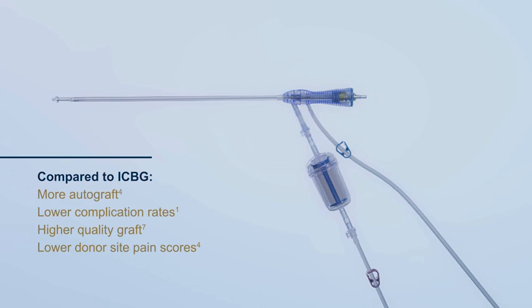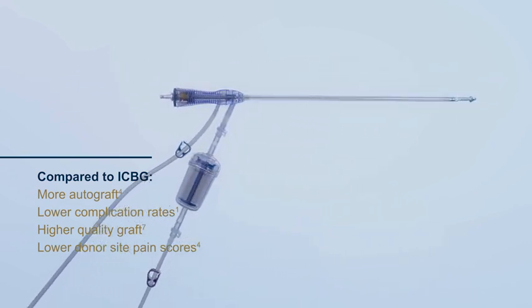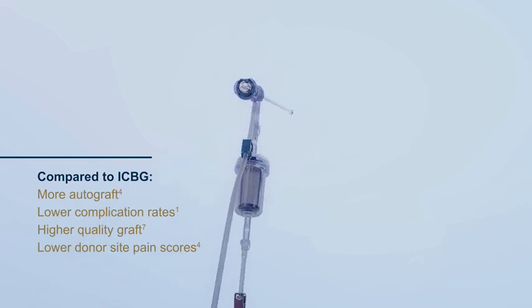The RIA2 system is an effective method for obtaining large volumes of autologous bone graft, while reducing the complications associated with standard reaming.